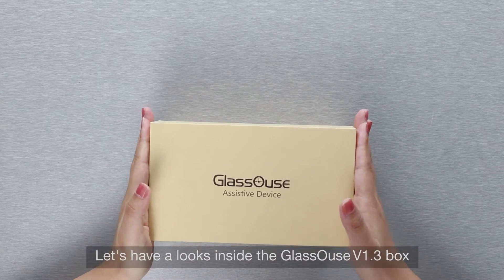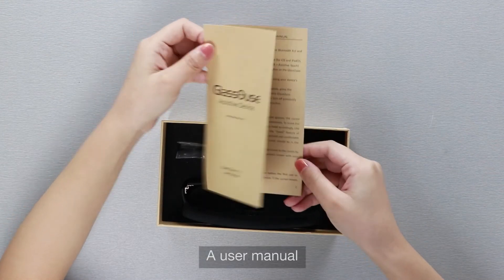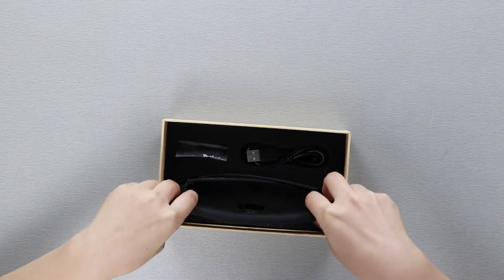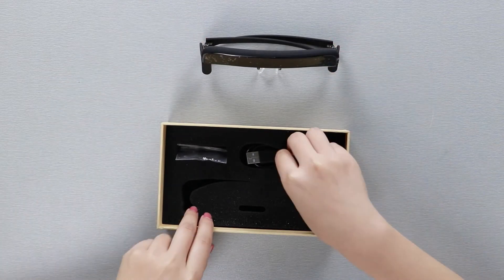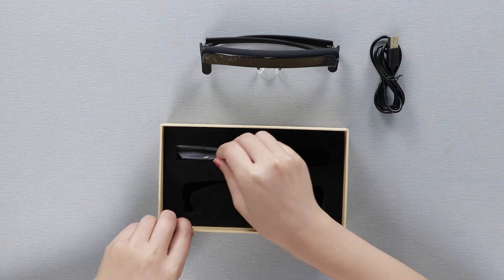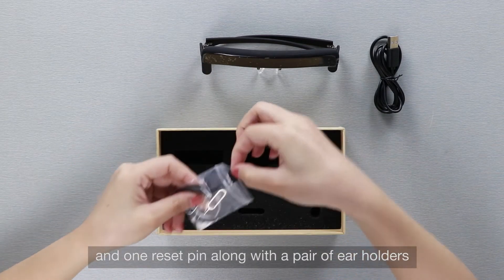Let's have a look inside the GlassOuse V1.3 box. Inside you'll find a user manual, one GlassOuse version 1.3, one standard charging USB cable, one reset pin, and a pair of ear holders.